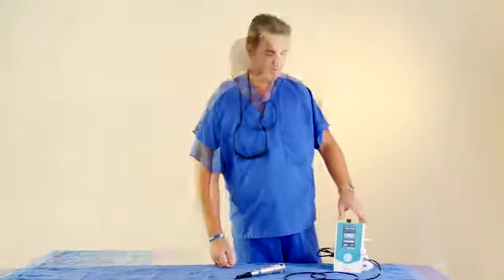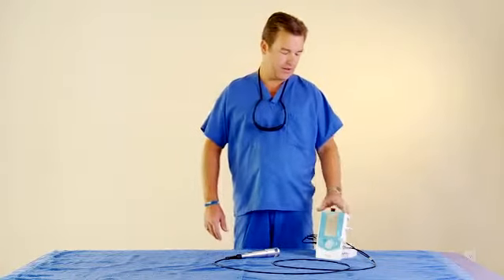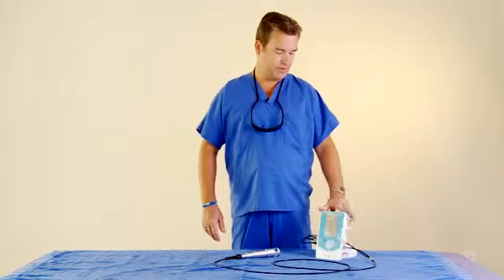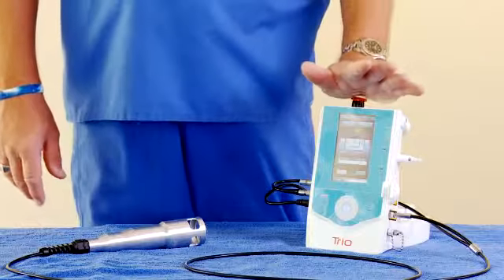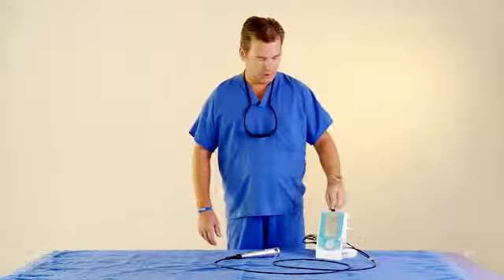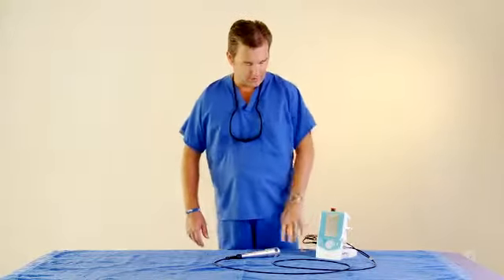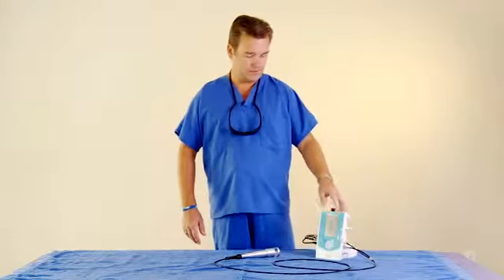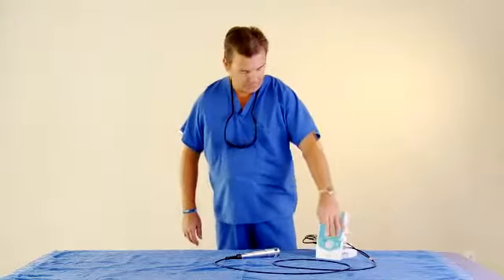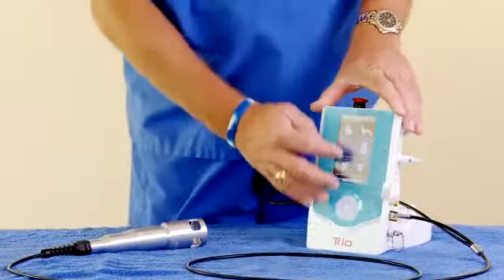If you ever have an emergency situation where you have somebody enter a room that doesn't have safety goggles on, or you're in a situation where you can't treat a patient efficiently and you need to stop very quickly, you can depress the stop key. It won't let the laser turn back on until you twist it and release it. So there are several protocols that you can use to be safe. First is the finger switch, second is the toggle switch over here, third would be the standby, and then the fourth is the emergency stop.